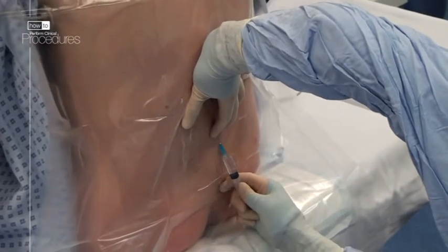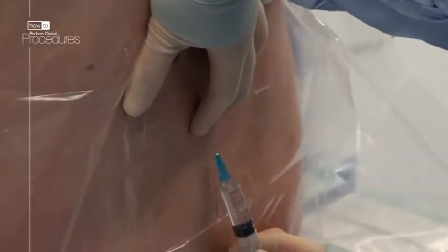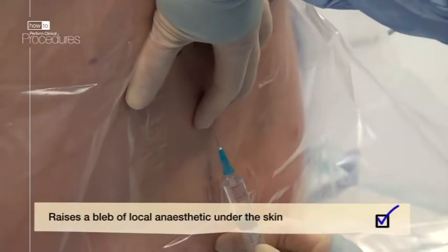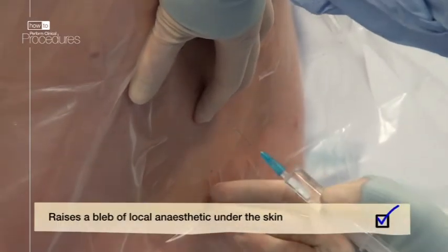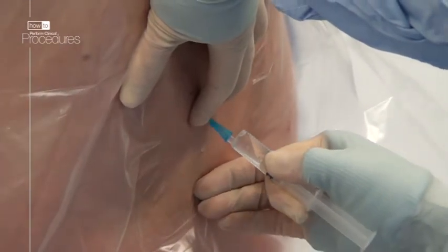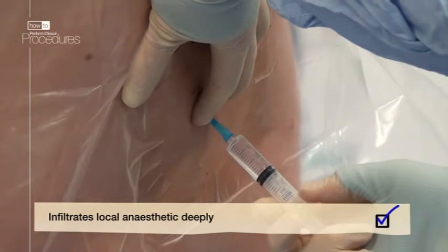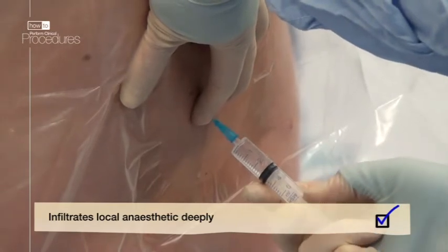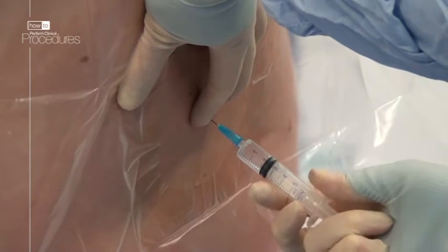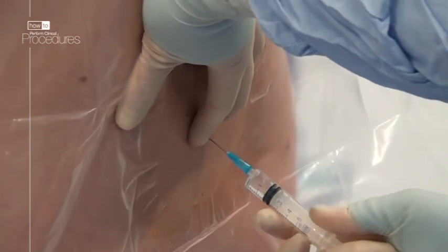Confirm the level you're targeting using your previously made mark. Raise a small wheal of local anaesthetic under the skin. Then turn the needle in the direction of the interspinous space, aspirate to check you haven't entered a vessel, and infiltrate in this direction whilst withdrawing. Note that the resistance to infiltrating the local is slightly higher in the midline — this means you're in the right place.